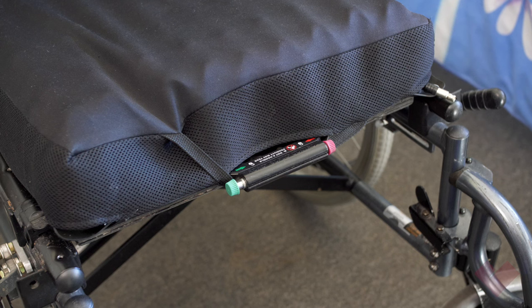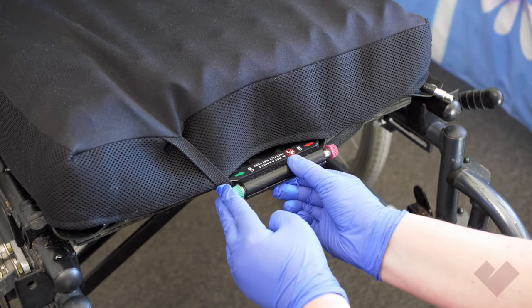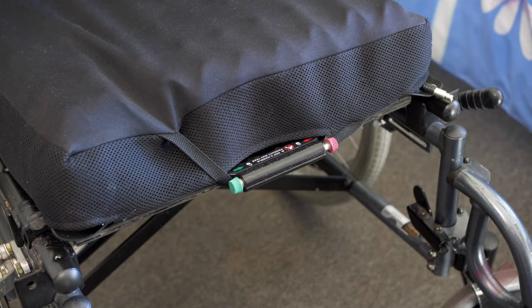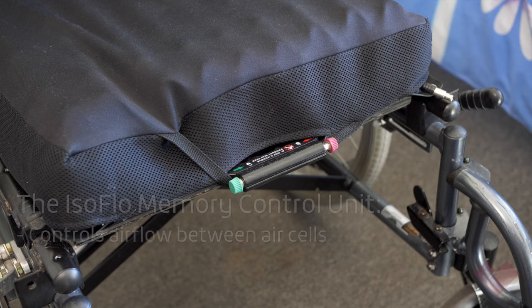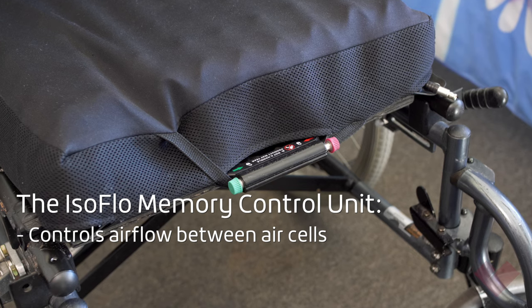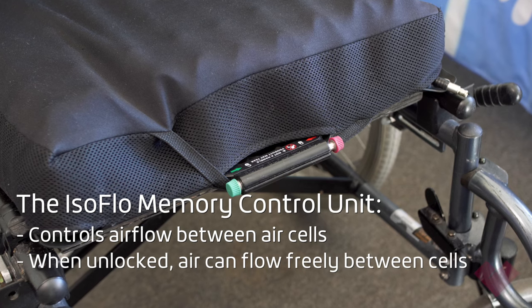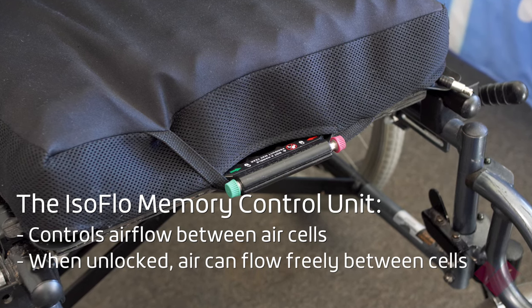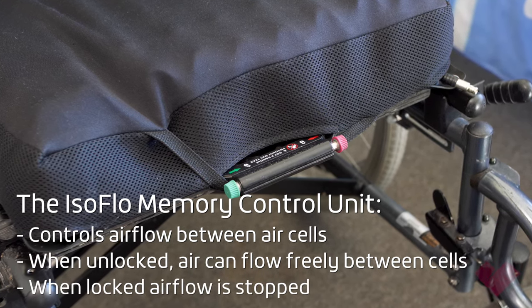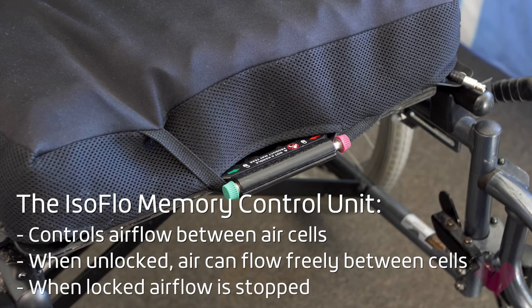While wearing gloves, ensure the isoflow memory control unit is pushed to the right so the airflow between sections is unlocked. The isoflow memory control unit controls airflow between the four sections of the cushion. When unlocked, the air can flow freely between the four sections. When in the locked position, airflow is stopped, which maintains the person's desired seating position.